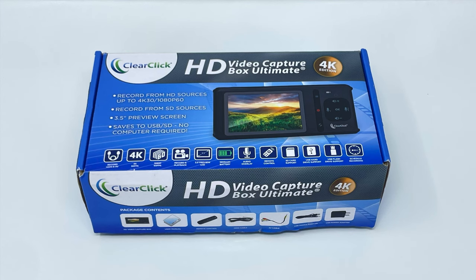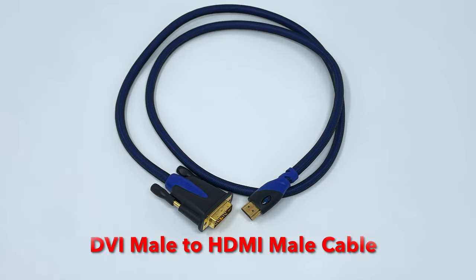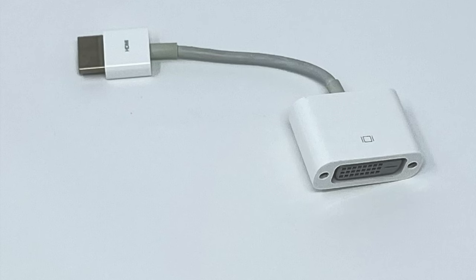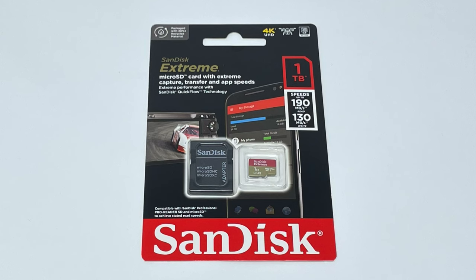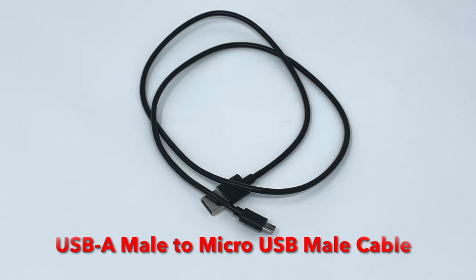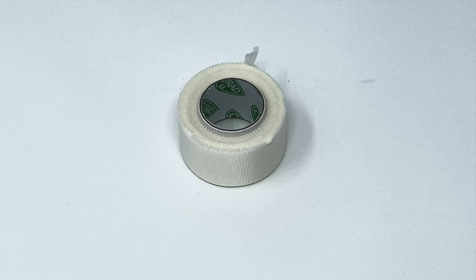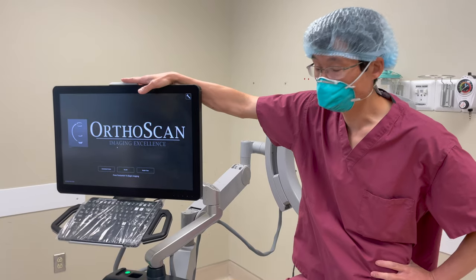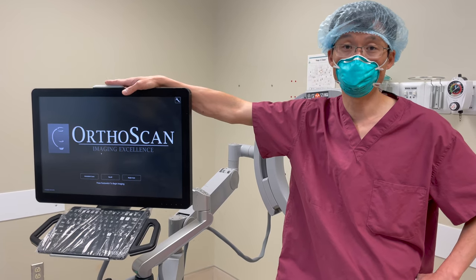Here we have photographs of all the important things you're going to need to record videos. This is the ClearClick video capture box. This is a DVI male to HDMI male cable, and this is a DVI female to HDMI male cable. The device does not have any built-in memory, so you can use a micro SD card or a USB jump drive. This is a USB-A male to micro USB male cable, and you need some tape as well.